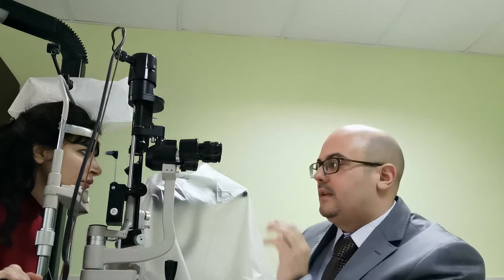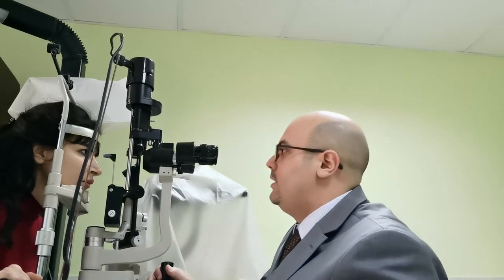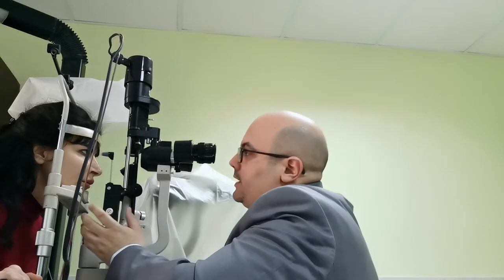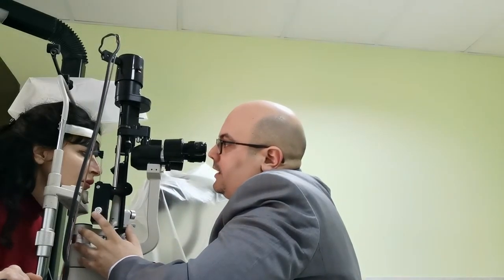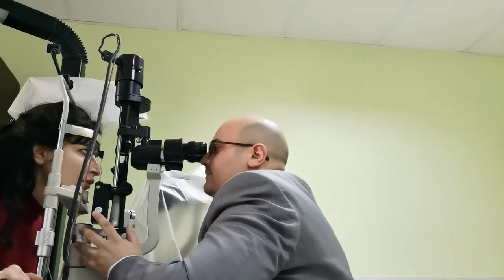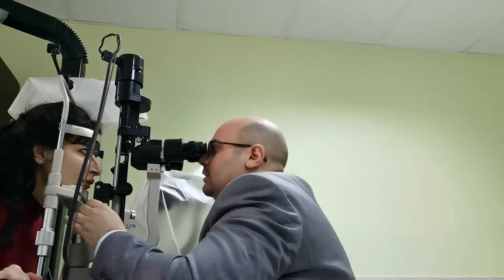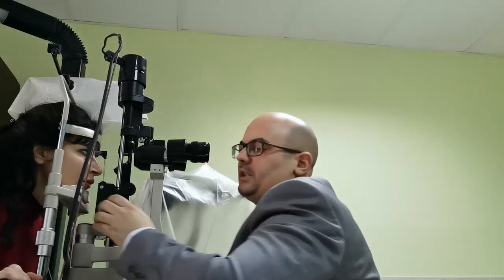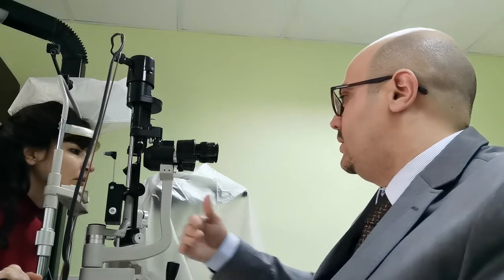After putting a numbing drop, instruct the patient that this plastic part will touch your eye, as we will see right now. You take the pressure, and then you ask the patient to go back.